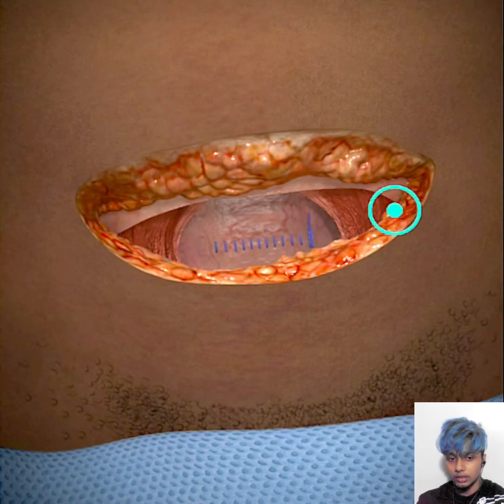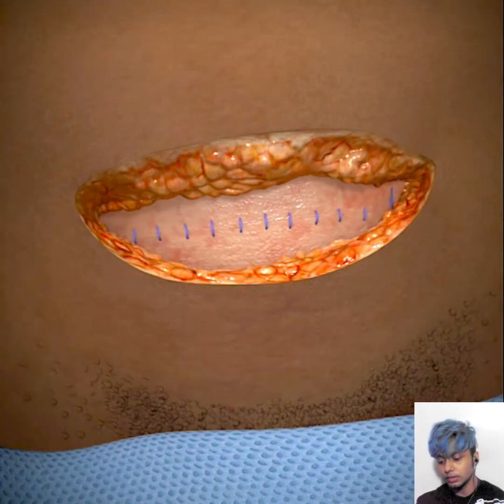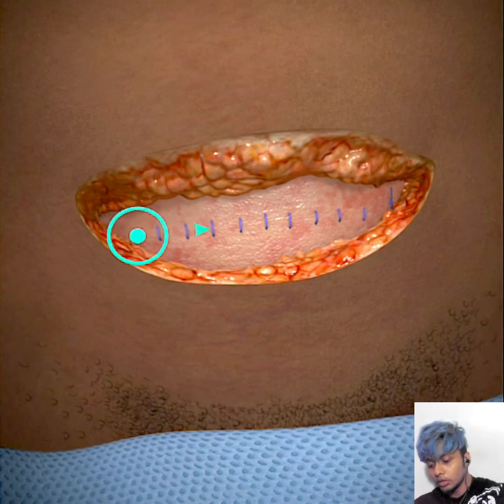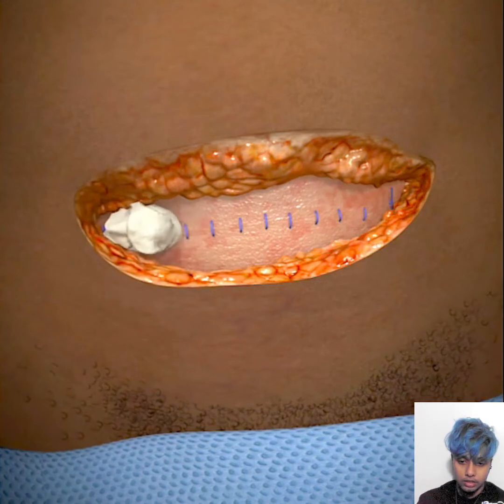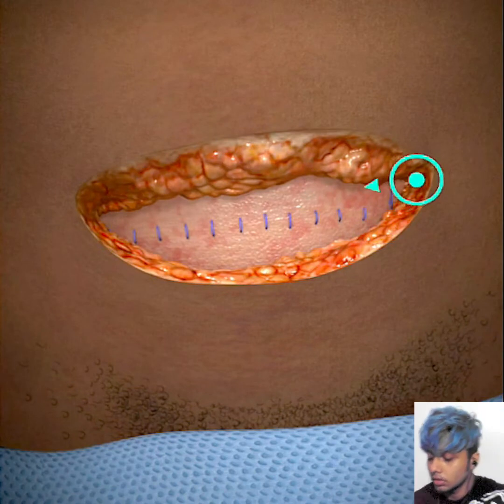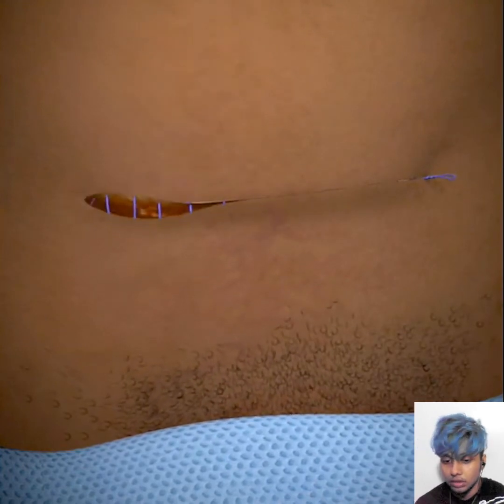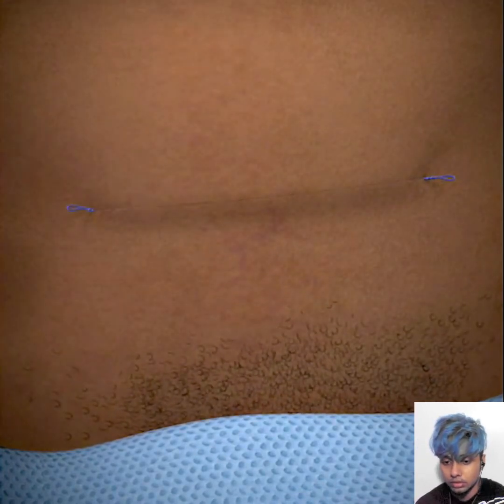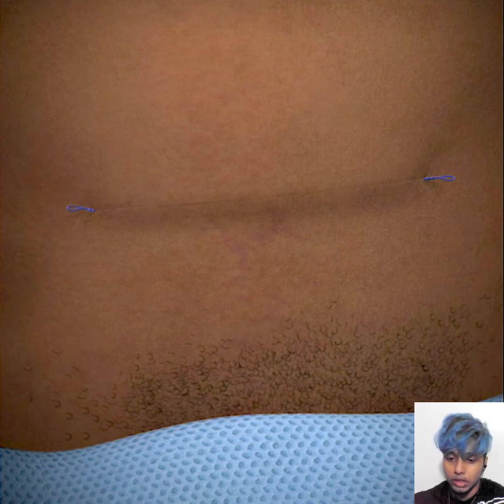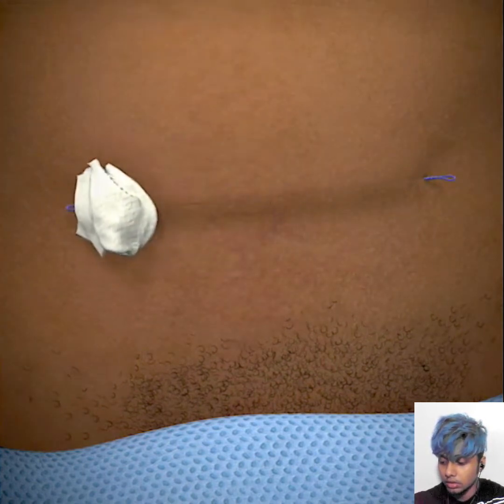Have to suture it properly. We'll now suture the fibrous fascia. We'll confirm hemostasis at the subcutaneous level. Hemostasis means checking if any bleeding is appearing or not. Now as this is done, we'll now apply a bandage properly. That's it. And now we'll go towards the next operation.